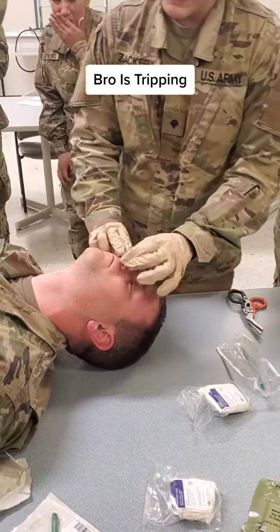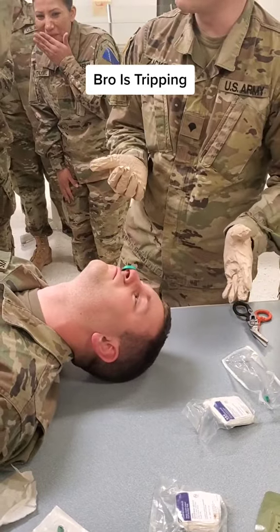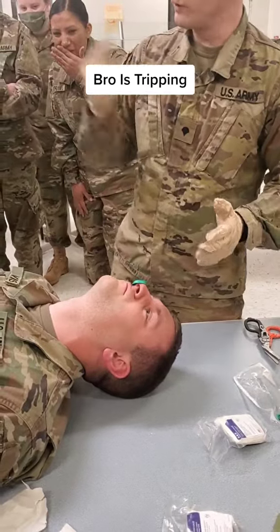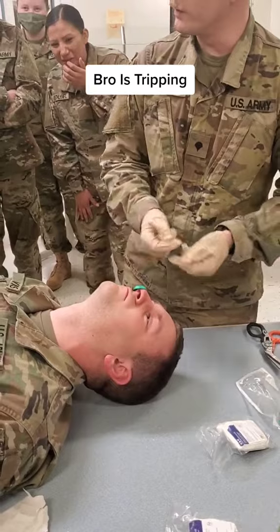Now we're in the airway. Because he's conscious, he's not shooting this out — he's kind of keeping it in. If they're unconscious, I'm not kidding, that thing will go from here to there. They'll just shoot it right out of their nose.